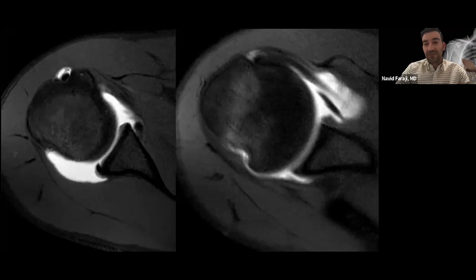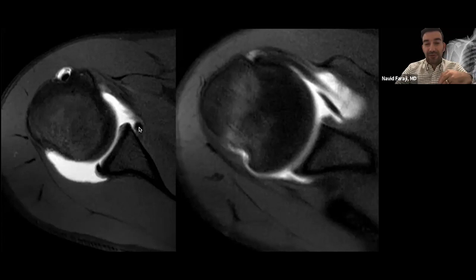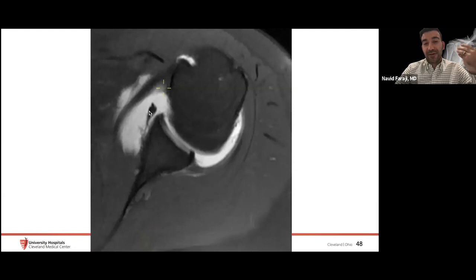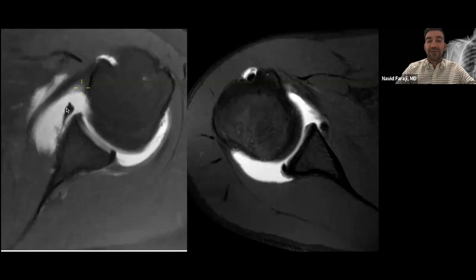We can also see a Hill-Sachs and Paxian deformity, and a labrum that is balled up and medially scarred down. Two important patterns: the ALPSA (Anterior Labral Periosteal Sleeve Avulsion) — the periosteum is elevated and the labrum is avulsed, medially bunched up and scarred down. In contrast, the Perthes lesion — the labrum is torn from the glenoid with periosteal elevation, but the labrum is not medially retracted, still attached to the periosteum. Side by side: ALPSA shows medial bunching; Perthes shows elevation without retraction.